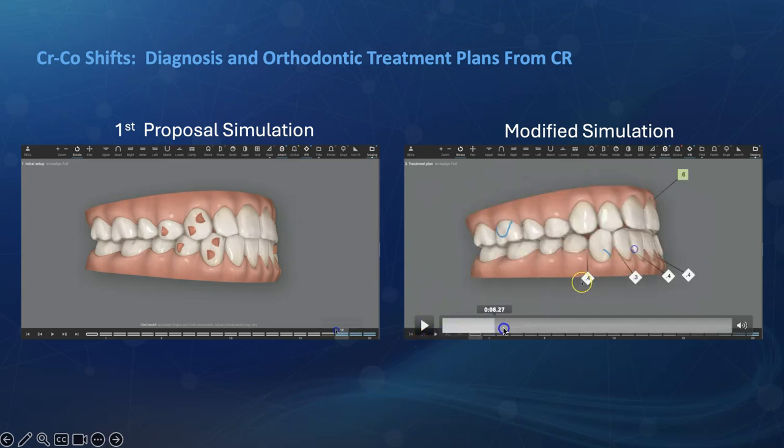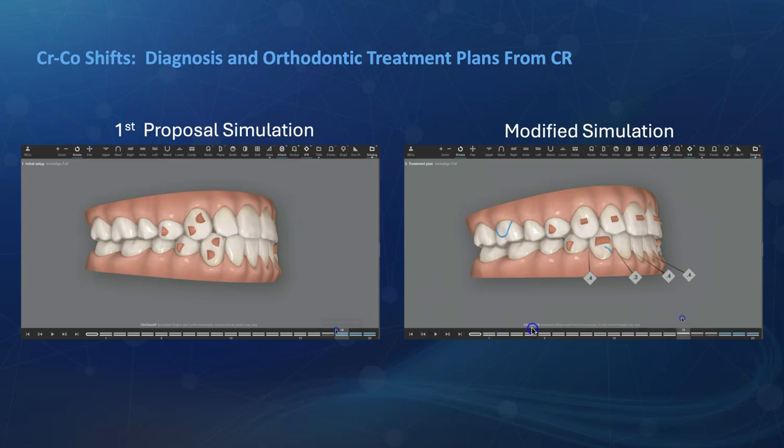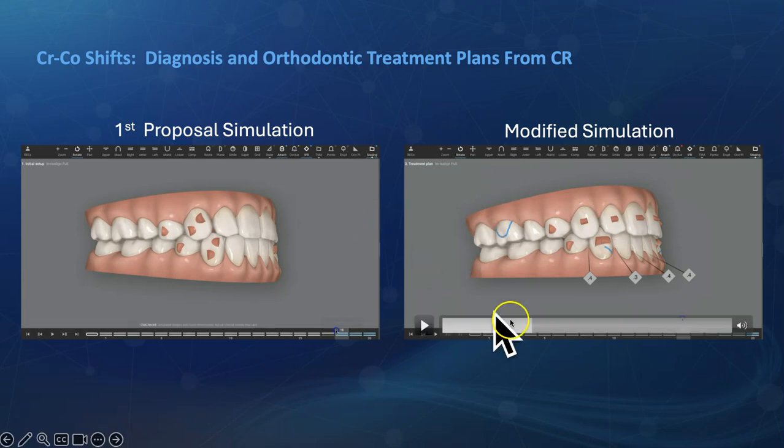So you'll notice that a little bit later in the treatment, once she's out of crossbite, I can erupt the anterior teeth. She's still going to be wearing class 3 elastics, but I'm assuming that a bite jump will occur to bring these back teeth together. You see the bite jump here. It's not the maxilla moving down. It's probably going to be the mandible moving up. But the point is, I'm not erupting posterior teeth to close that open bite. I'm assuming that if she wears enough elastics along with lower IPR and alignment of the top teeth, the interference will be eliminated.